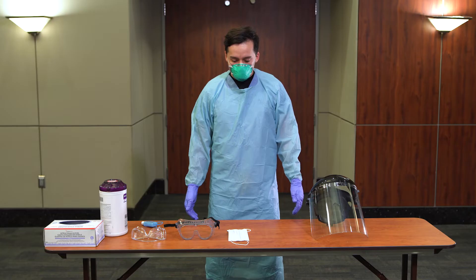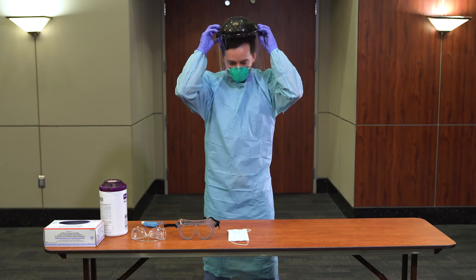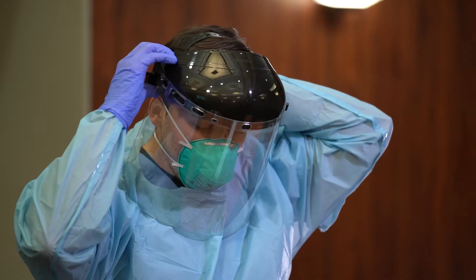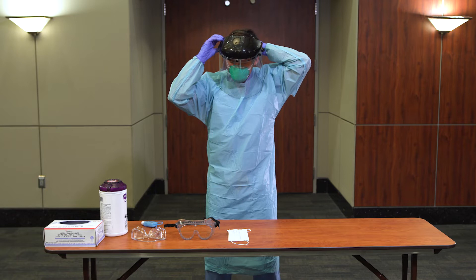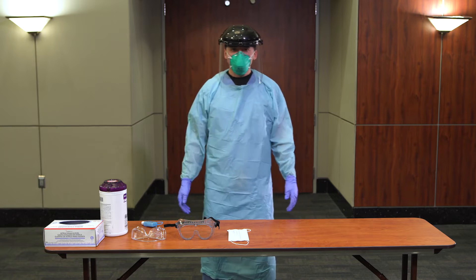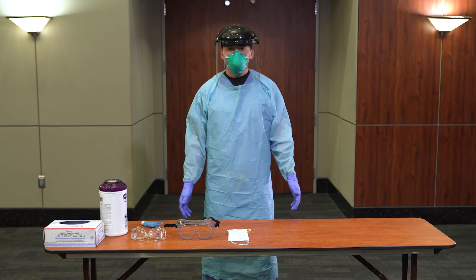Don eye protection. To don a reusable face shield, place the face shield on and ensure the harness is securely positioned around the forehead and the back of the head. Adjust the knobs on the back and side of the device to ensure a secure fit. You may now enter the patient's room or care area.